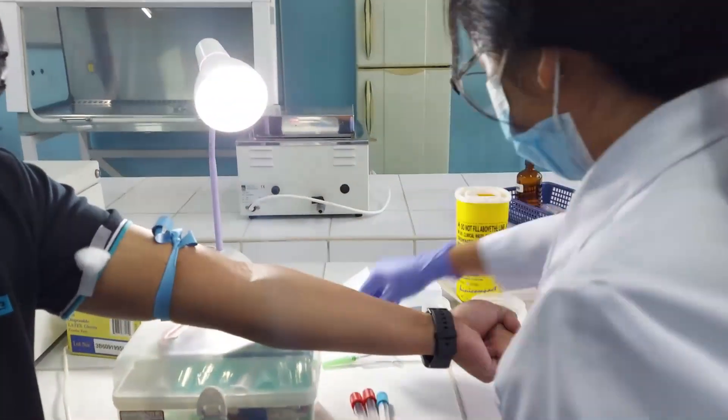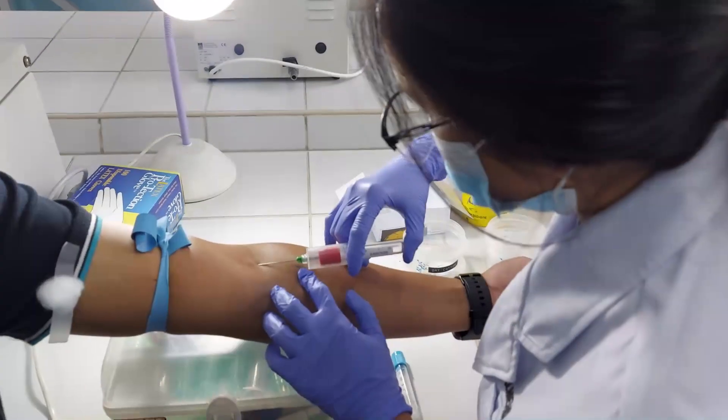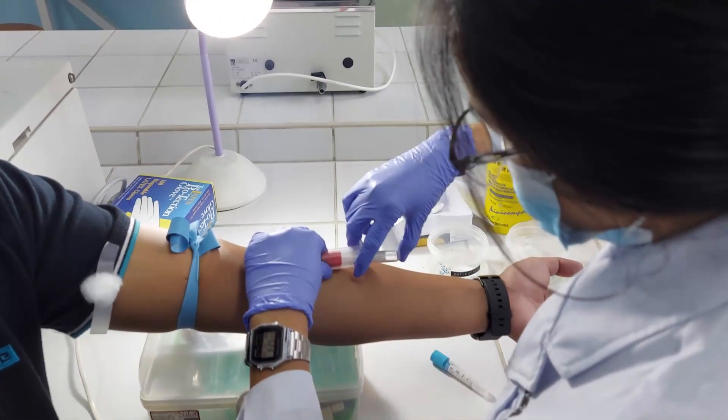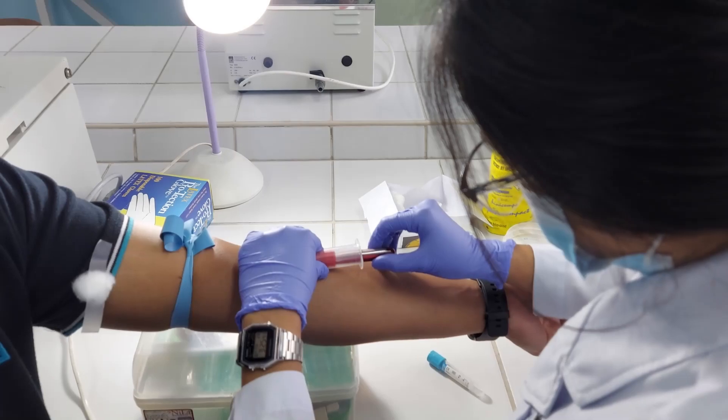First, collect 5 ml of non-anticoagulated whole blood and transfer it in a clean test tube, or just make use of the blood sample you collected using the red top tube.